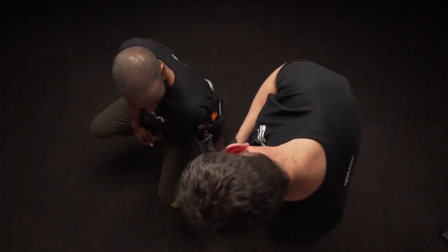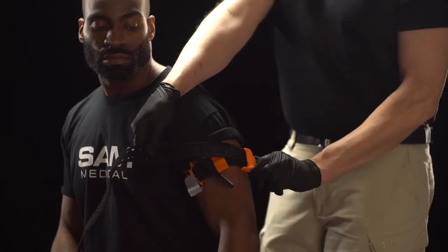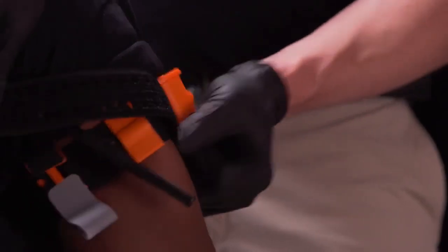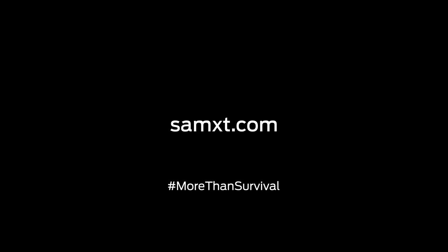To remove Sam XT, undo the time band, release the windlass from the hook and untwist it. Lift the tab on the front of the TruForce buckle to allow prongs to retract. Dispose of device per facility policy. To learn more, visit SamXT.com.